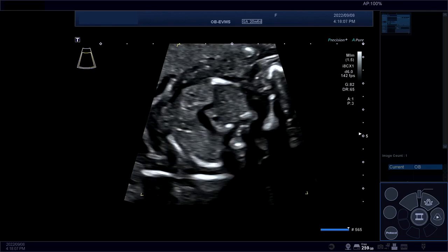So in this view, you actually have only the aortic arch. You're above all the pulmonary circulation. You have the top of the aortic arch, and don't mistake this with an abnormal three-vessel trachea view, because this arises in the middle of the chest, in the middle of the upper chest. So that is the classic aortic arch view. You see superior vena cava, aorta, and the trachea right here.